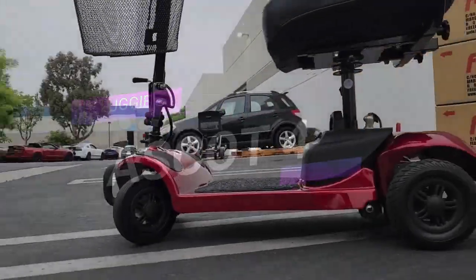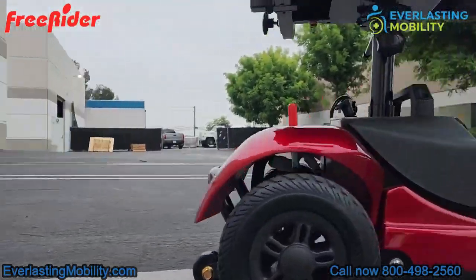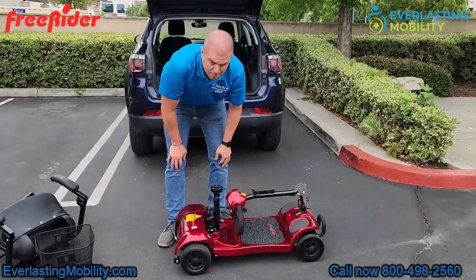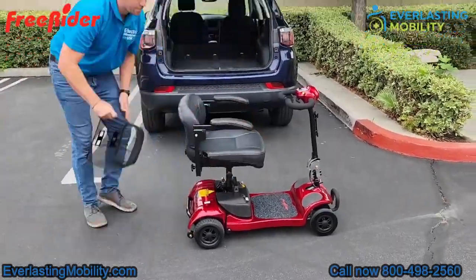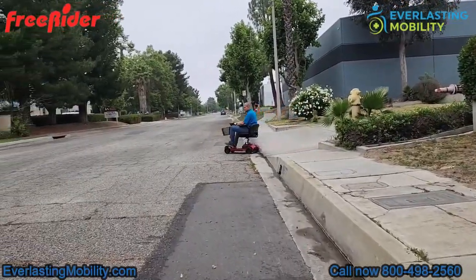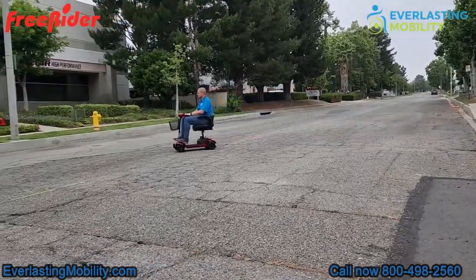This scooter can support up to 325 pounds of weight and it's perfectly tailored for tight corners and narrow spaces. The Ascot 4 promises effortless navigation just about anywhere — whether you're navigating hallways, elevators, or bustling streets, the scooter adapts to your every need. Let's get into it and we'll show you some more about it.